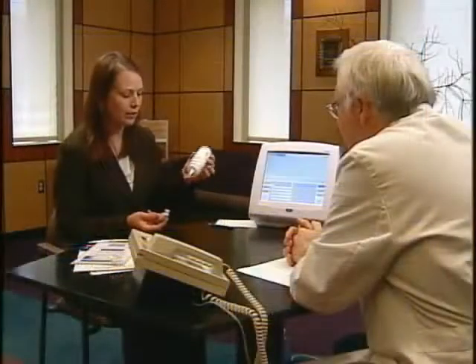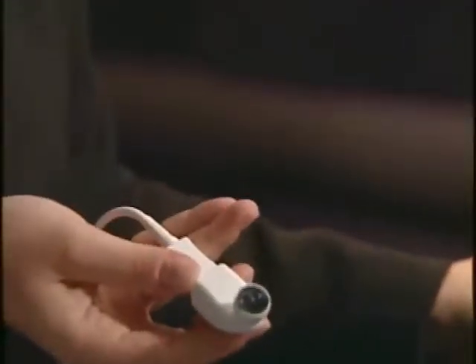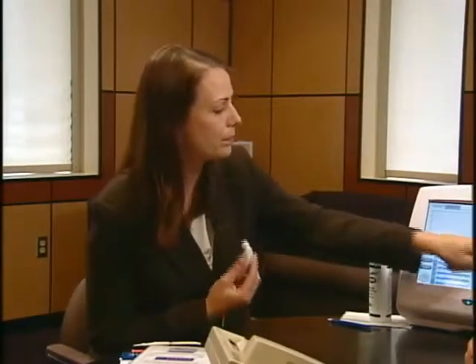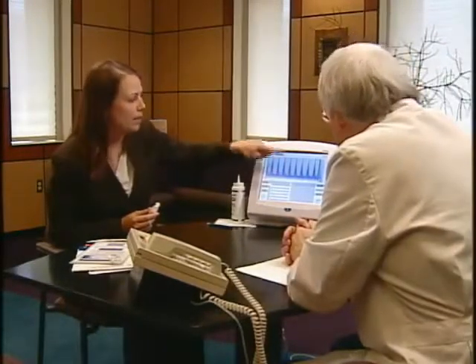To measure flow, you just take the gel and place a small amount on the end of the transducer. Gel is the only consumable with the product. And I'll show you the aortic acquisition here. So I just touch Start, place the probe on my neck, and I'll acquire a jet. Once I'm happy with the signal, I touch Freeze, and you probably noticed the automated tracing system that was tracing over the profiles. That's called Flow Tracer.